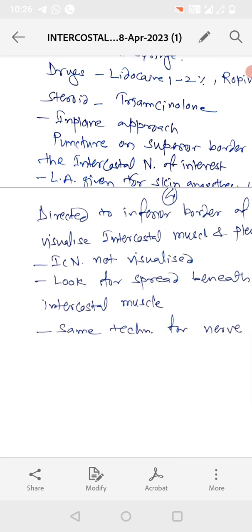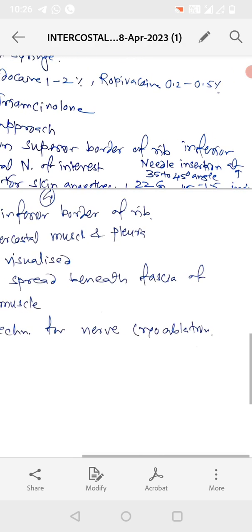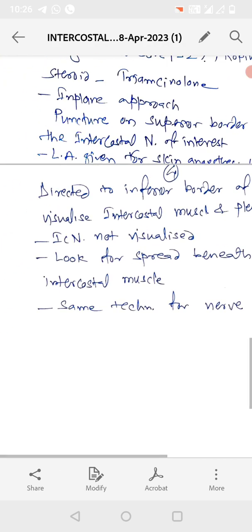Approach. It is in plane approach. Puncture on the superior border of the rib, inferior to the intercostal nerve of interest.